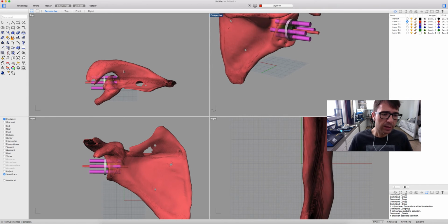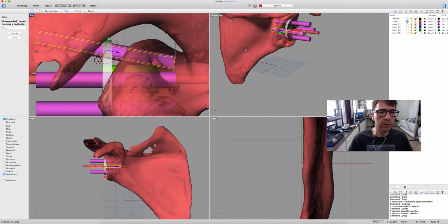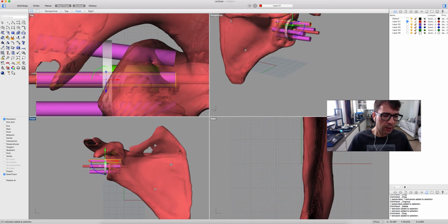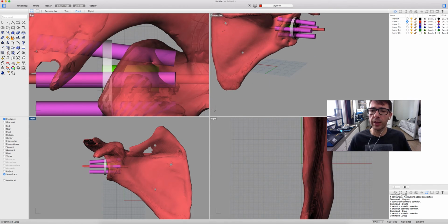We can check the location of the screws. We can move the location of the screws. Here we're going to rotate in order for this screw to have a better position. We can rotate any screw. We know for this arthroplasty we can rotate up to 10 degrees. So we can rotate, and by doing that we can check the direction of the screws, okay, as you can see here, and we can create a patient-specific guide.